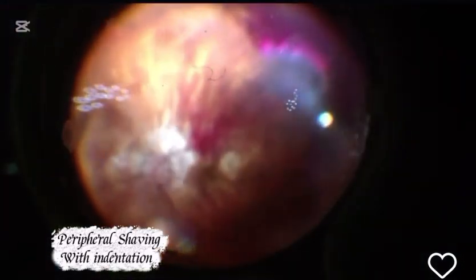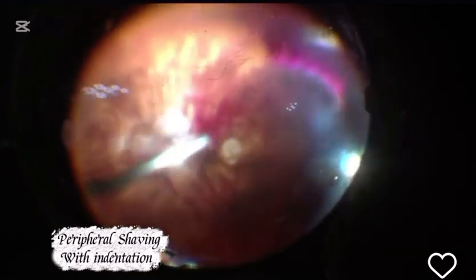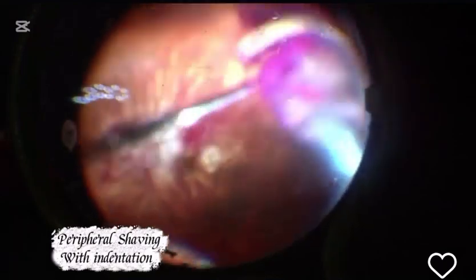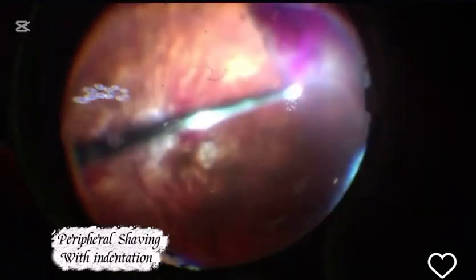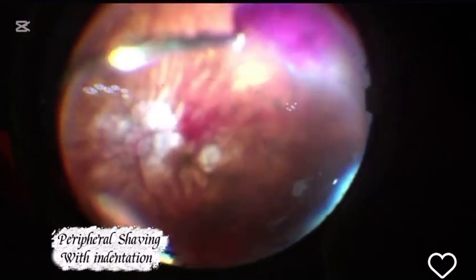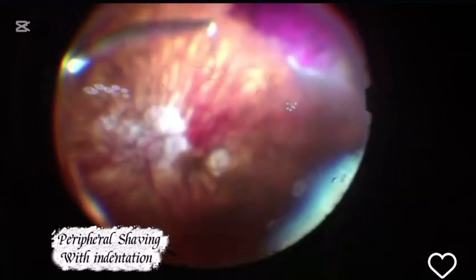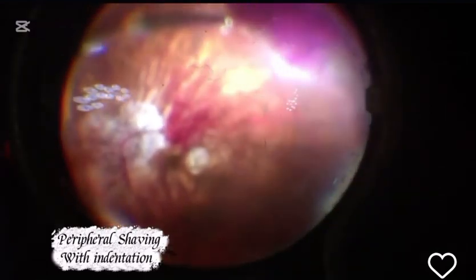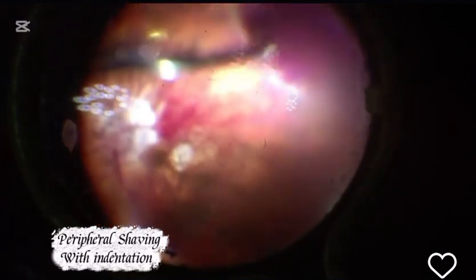And next I proceed for the shaving with indentation. At the same time, exploring the periphery if there are any breaks, as seen here. This is a case of high myopia, so the challenges might be risk of iatrogenic breaks. The large globe, this patient's axial length is 30, so the handling process inside the globe is a little bit challenging. However, it will be easy once you get the hang of it.